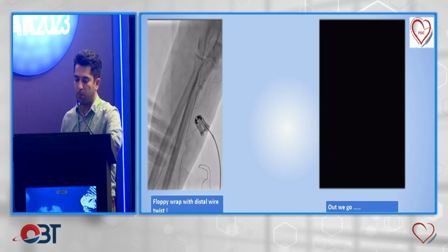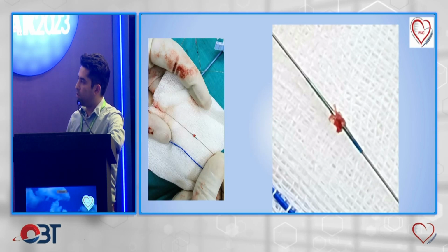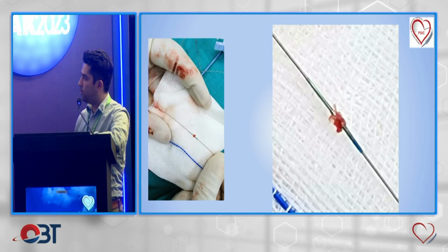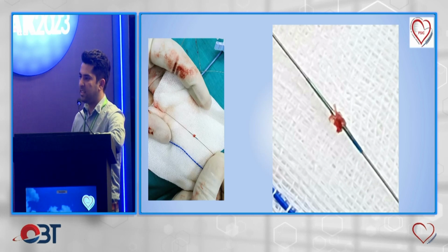But at the end, we took a floppy wire, wrapped it around the distal wire, which had been placed in the sheath, along with the sheath, and successfully overcame the complication. And this was basically the tip of the broken balloon, which we had seen over there at the ostium of the LMS. This is the part of the balloon at high resolution: this is the shaft of the balloon, and this is the broken part of the balloon, which came out successfully and without any complications.